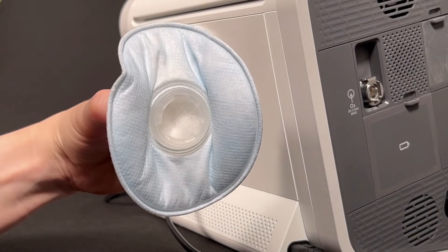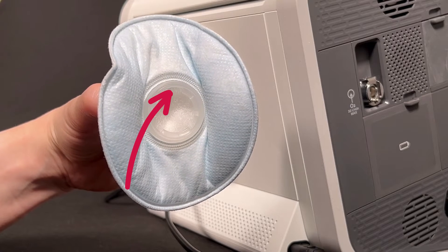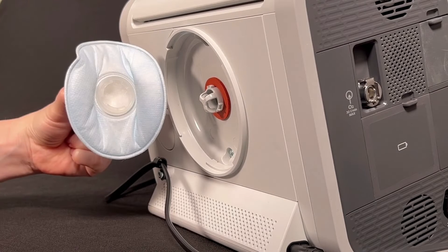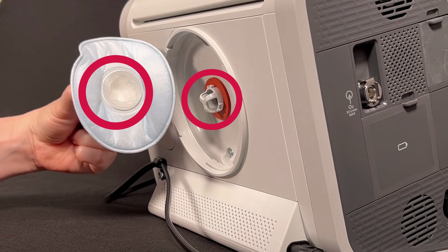Next, put the new particulate filter in. Hold the base of the filter with one hand. Make sure one notch in the base of the filter is pointed up toward the ceiling. Line up the notches on the base of the particulate filter with the notches on the filter mount in the Trilogy Evo.